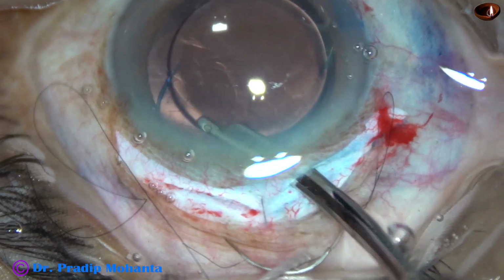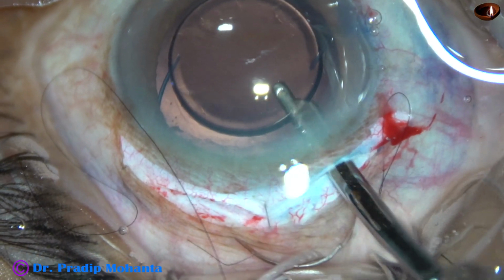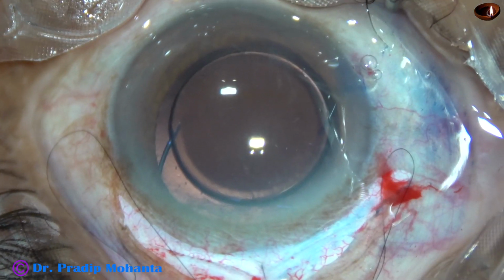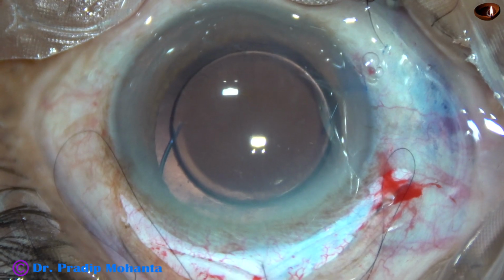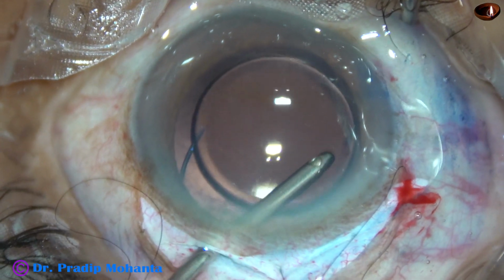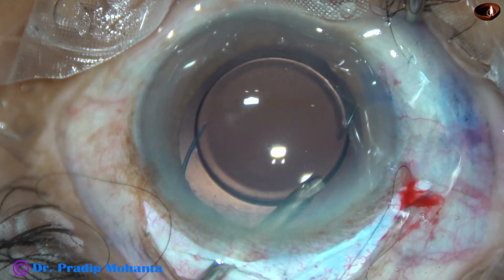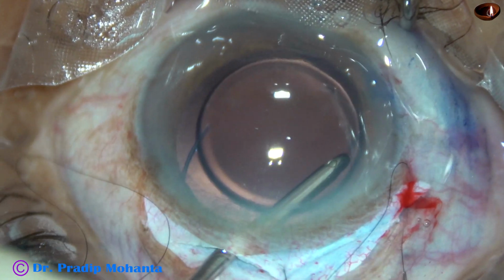And now thorough removal of visco is done. Visco is removed from the anterior chamber and from the capsular bag. The anterior chamber and capsular bag are irrigated nicely so that most of the visco comes out. In this case, I took the irrigating probe of the bimanual irrigation aspiration and did some more irrigation of the anterior chamber. Since this is a high flow irrigation, it could remove all the visco from the anterior chamber as well as from the capsular bag.